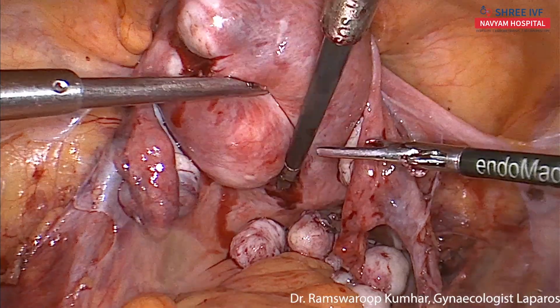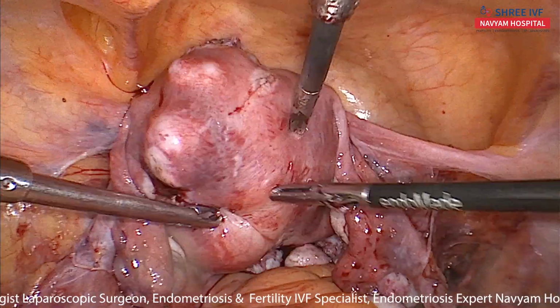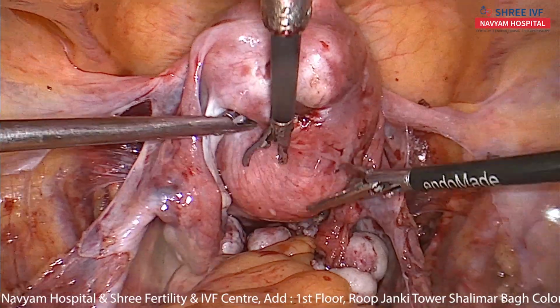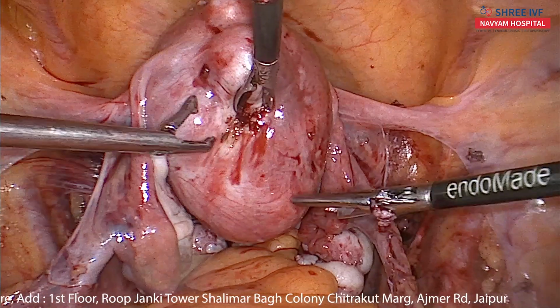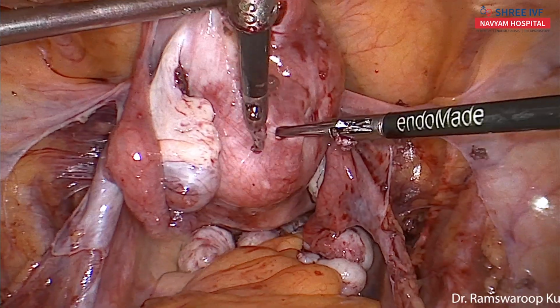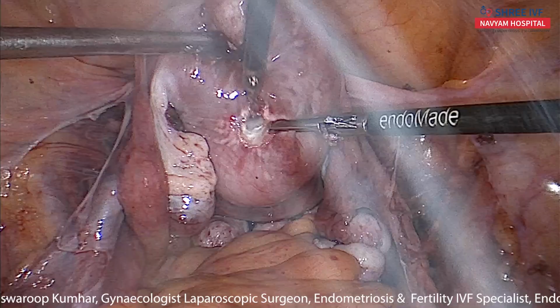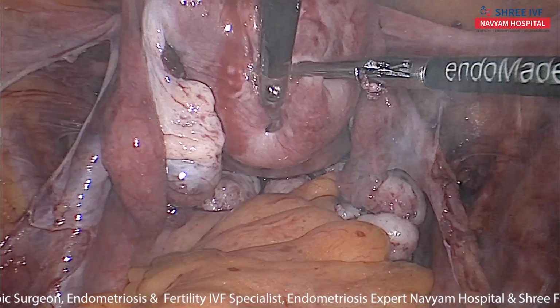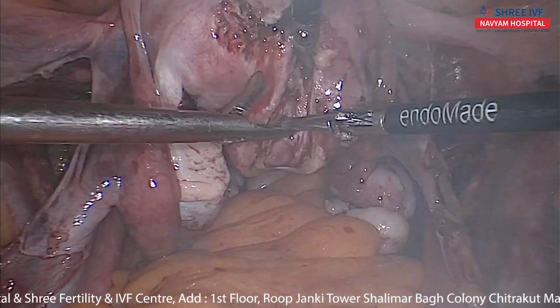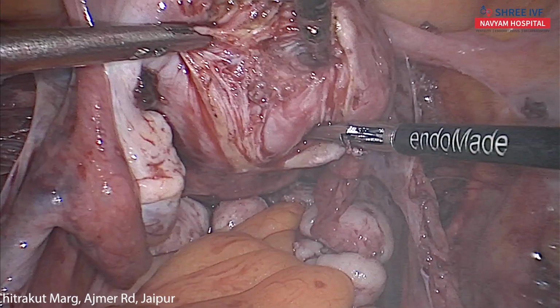Let's examine, planning for the incision. Mostly fibroids are slightly left side, so our incision will be slightly left on the posterior wall. The same vertical incision is being made. Sufficient length of the incision should be made for easy enucleation of the myomas.